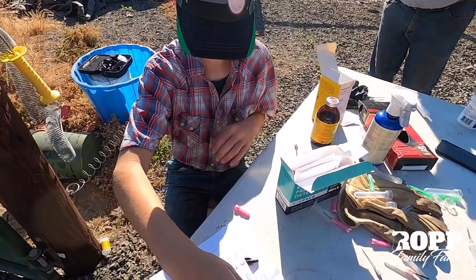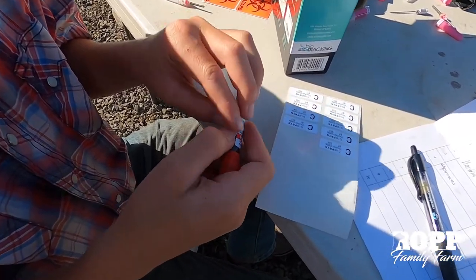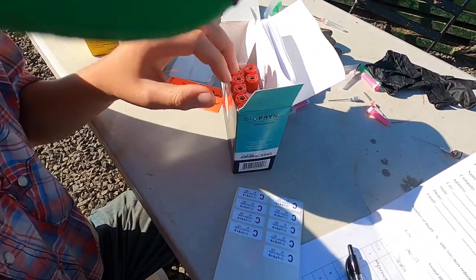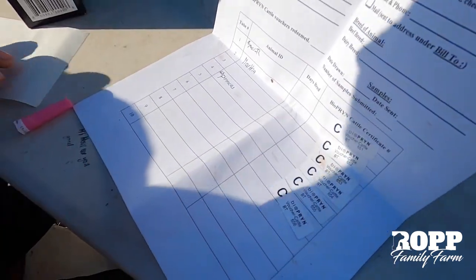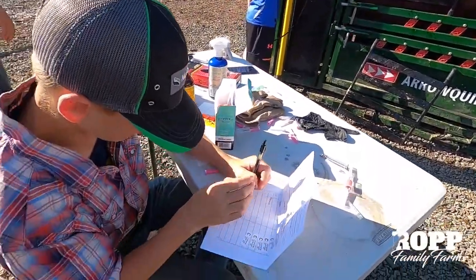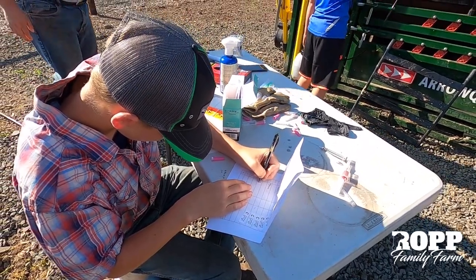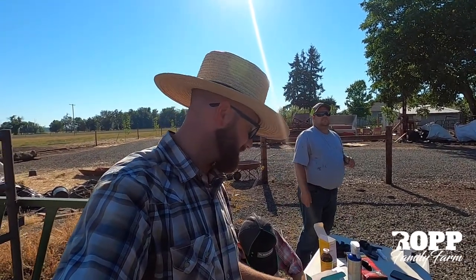They provide you with handy stickers for making sure you get the right cow with the right vial. He sticks one sticker on there, drops it back in, then sticks another sticker on the next line and writes down the name of the cow, which is BSG Rosewood. Once we're all done, we'll package those up — they have bags and stickers that say biohazard for shipping. We'll drop those in the mail and should have our results within a week with 99% accuracy. You can't beat that — thanks for stopping by today.